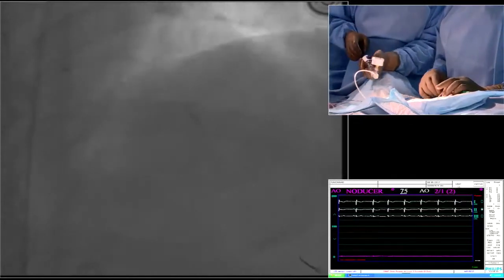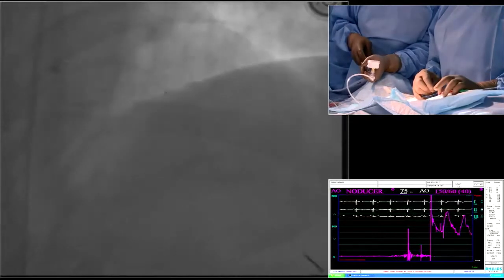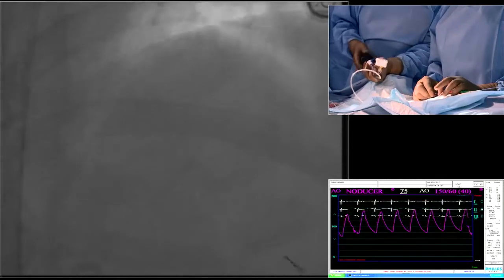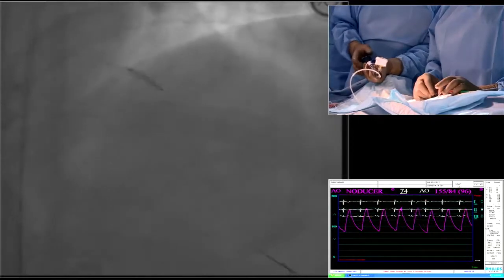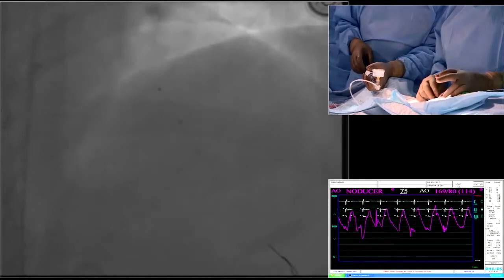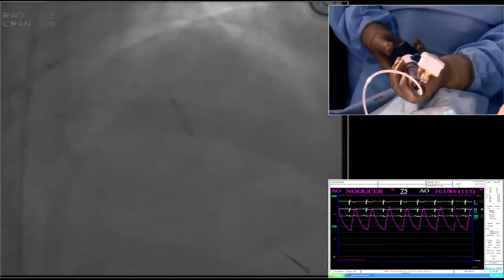Negative. Slipped. We'll go a little slow. 2, 4, 6, 8. No, still moved. Length is what, 15? Yes, 50. Go up again. 4, 6, 8, 10, 12.